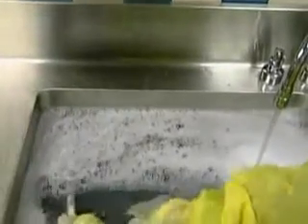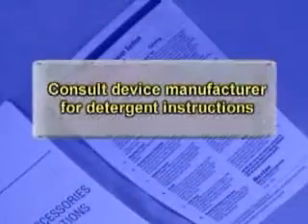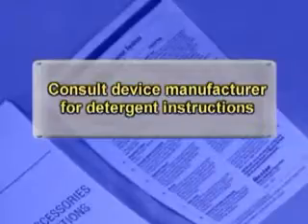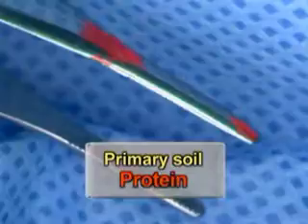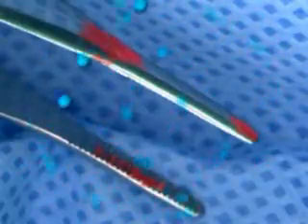Next, a detergent compatible with the materials in the device and suited for the type of soil is used. The device manufacturer should be consulted for recommendations for the type of detergent to be used. The primary soil in the sterile processing department is proteinaceous in nature. Coagulated protein may cover and protect bacteria from coming in contact with the sterilizing agent.